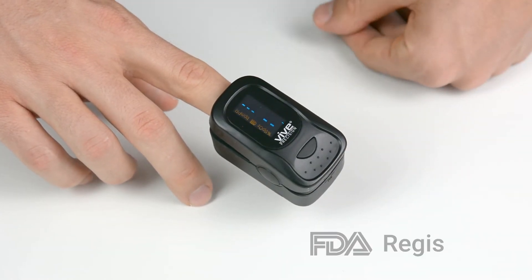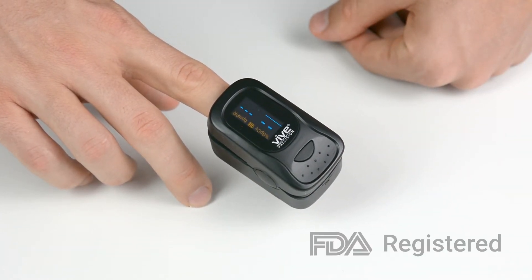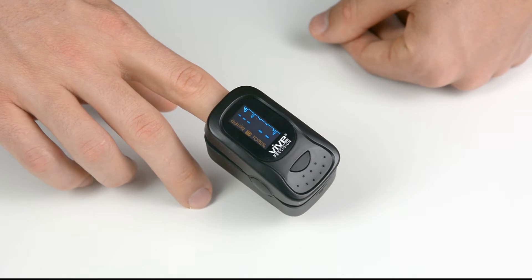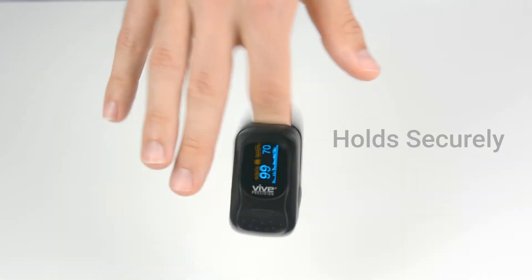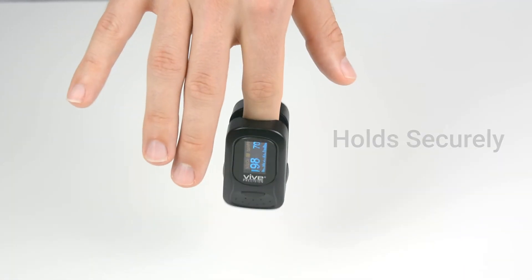Simply place your finger inside the vital sensor and have your blood oxygen level and pulse rate instantly available on an easy-to-read display. The device can be worn on your finger for extended periods of time and has an automatic power-off function when not in use.